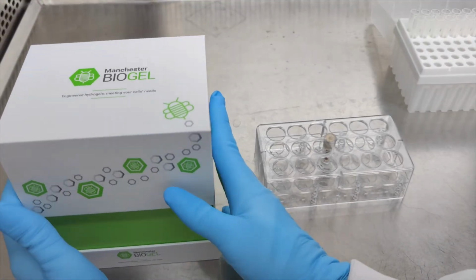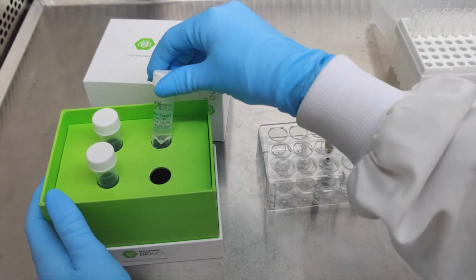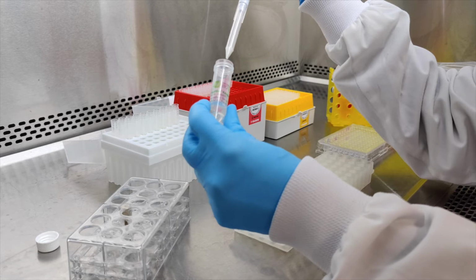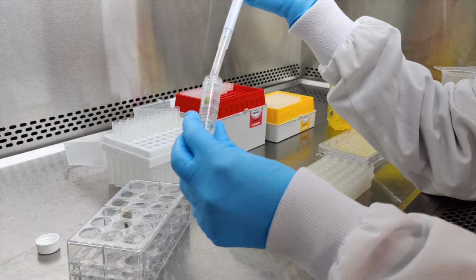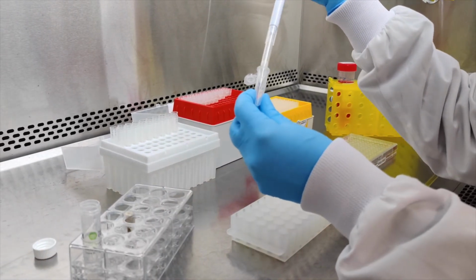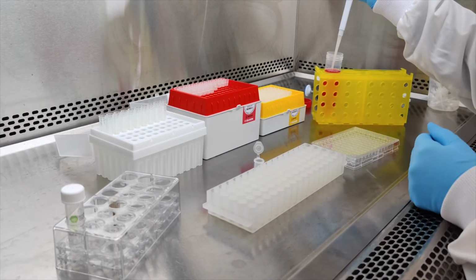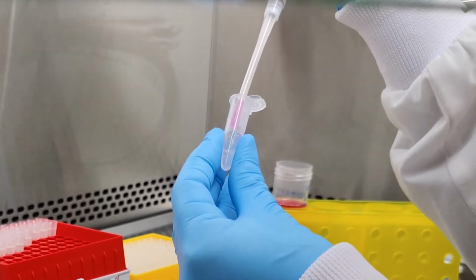Select which PeptiGel you would like to use for your experiment. Allow PeptiGel to warm up to room temperature. Using a positive displacement pipette, transfer PeptiGel to a new microcentrifuge tube. Add cell culture media either with or without cells, depending on your experimental design.